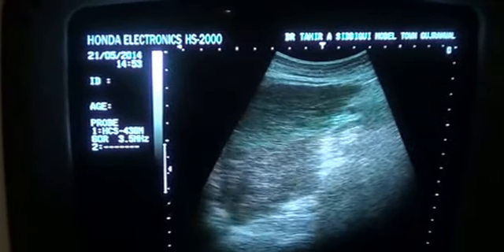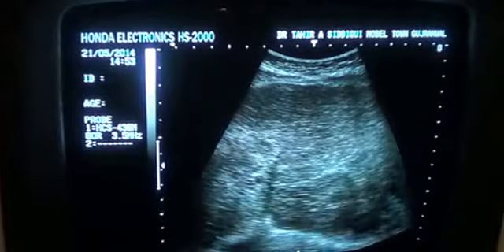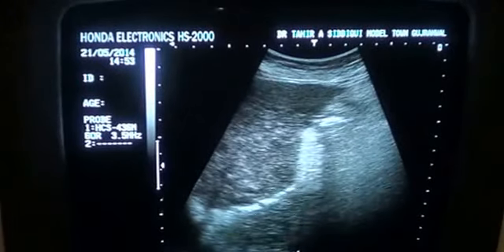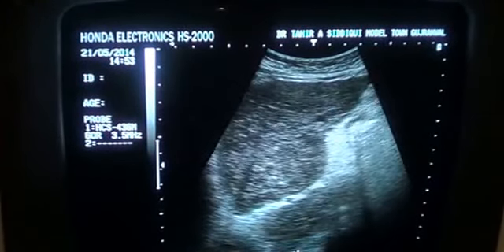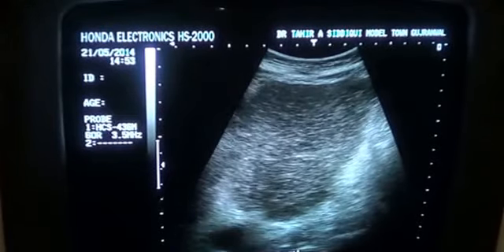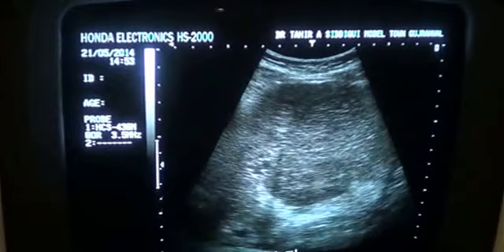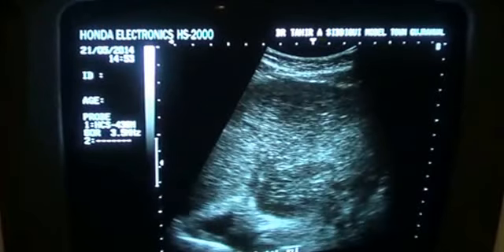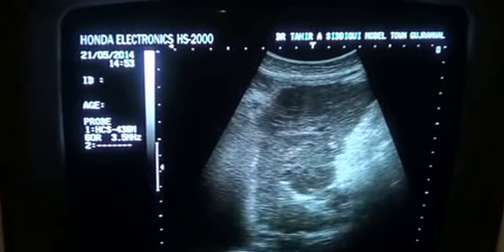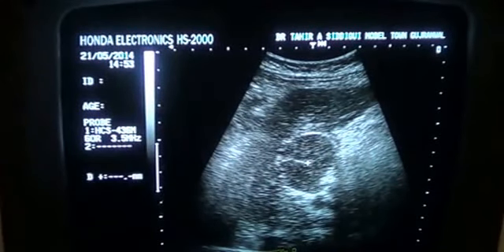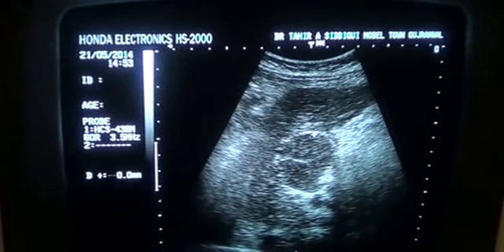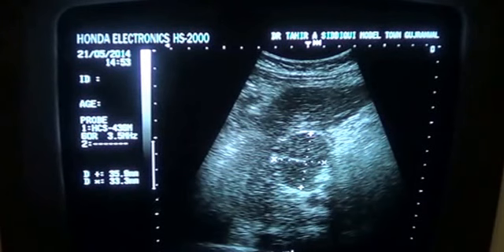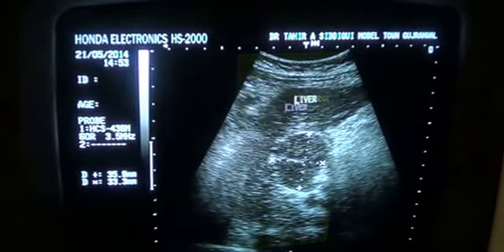Case of cirrhotic liver. This is the left lobe of the liver in longitudinal section, and there is a focal lesion seen in this segment. The focal lesion is measuring 35 by 33 mm. This is the liver.